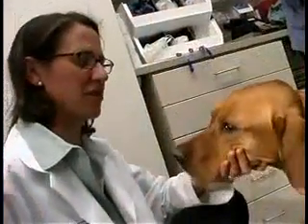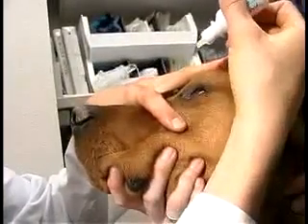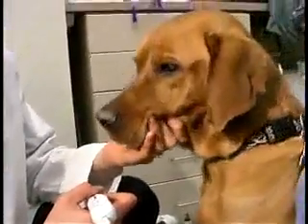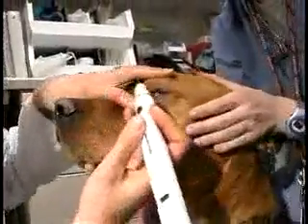One of the other things that we'll measure is their intraocular pressure, and we'll look to see if they have any signs of glaucoma prior to surgery, because that's one of the complications after surgery. And to do that, I would put a drop of anesthetic on his eye. You can't eat that. I'll just gently touch this.